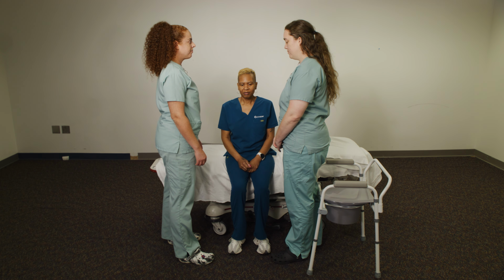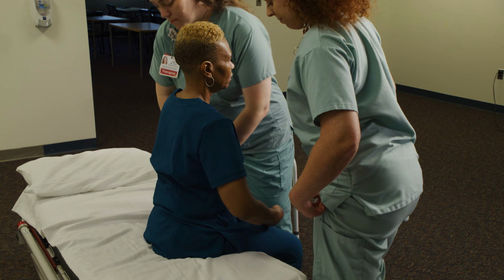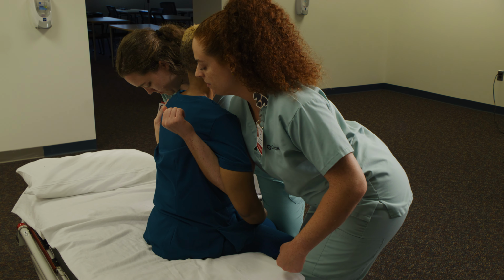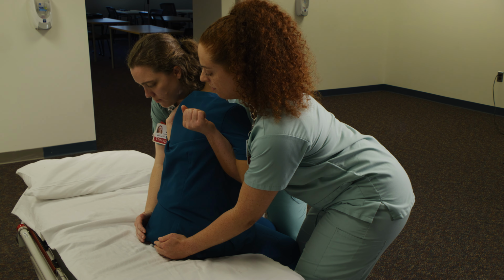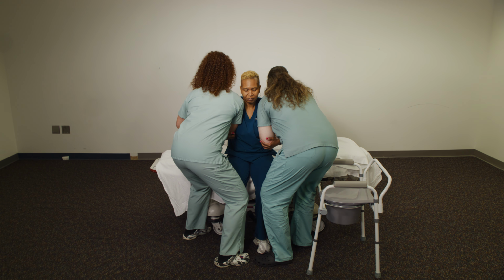For a 2-person transfer, the mobilizers will stand to the side of the patient. They will use their outside arm to scoop underneath the patient's arm, use the inside arm to scoop behind the patient, and have the patient grab the elbows.